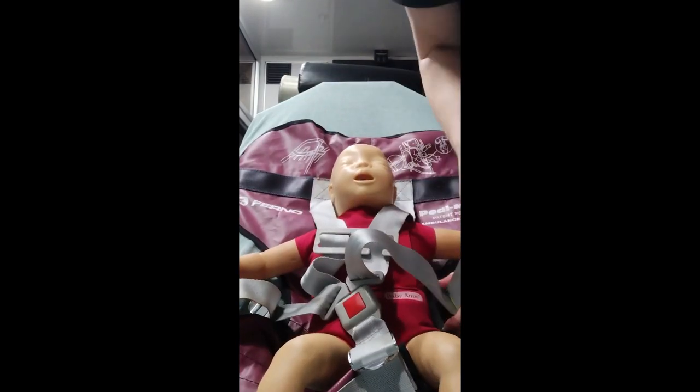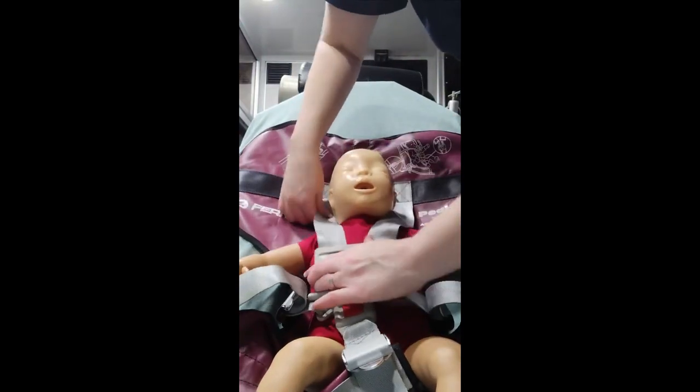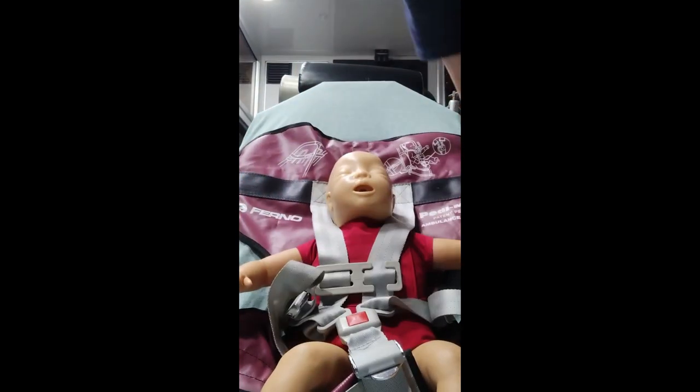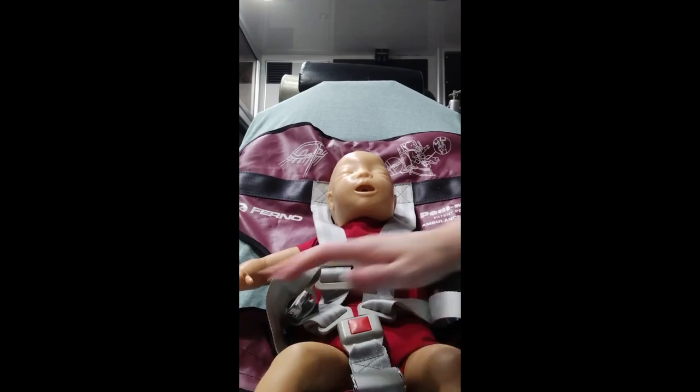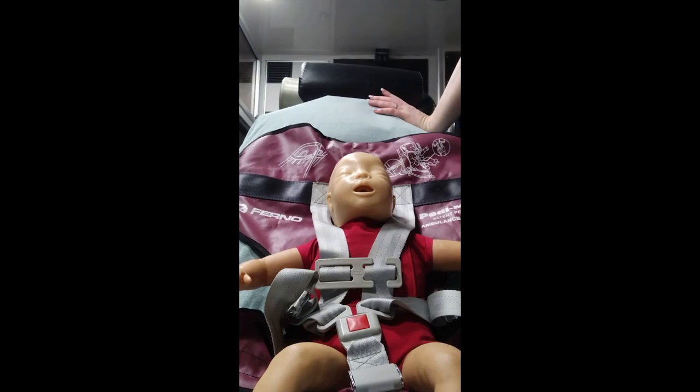These straps are of course adjustable, so we want to make sure they're tucked in. Now the PD mate is on there and the baby is on there.